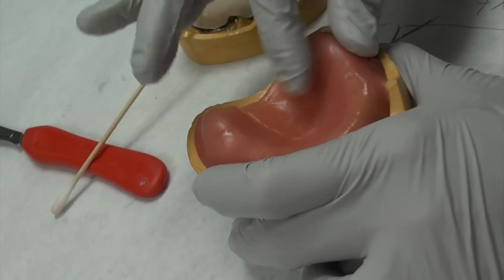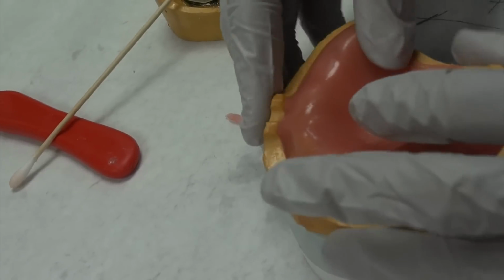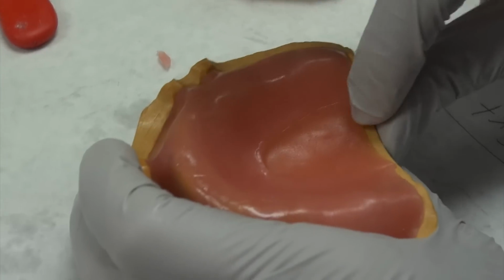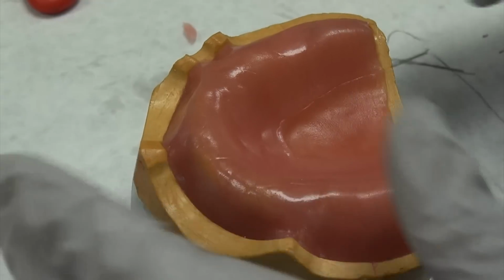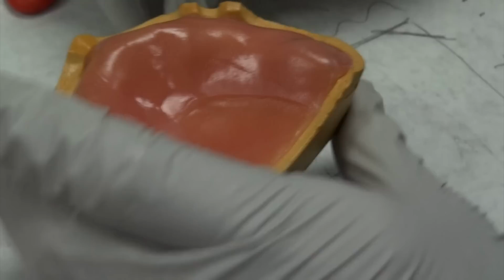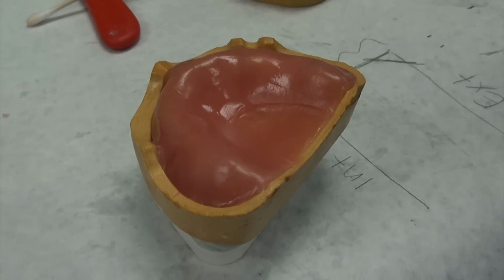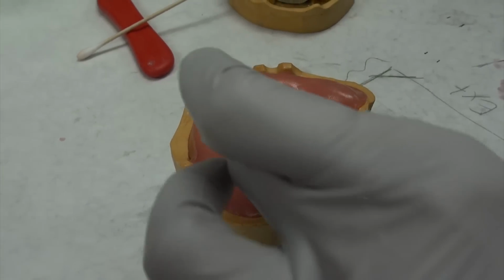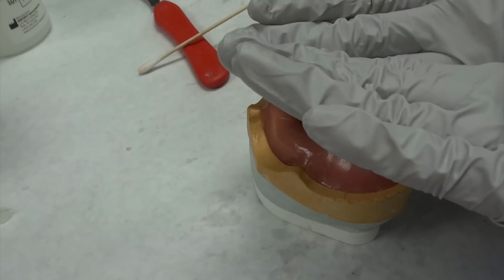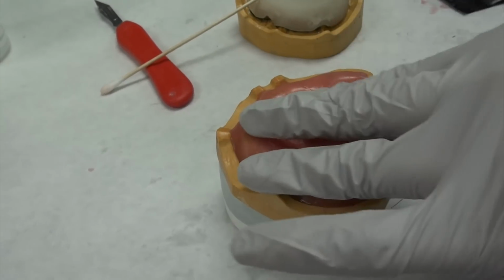So as we're putting the little piece that was missing, we're just gonna blend it back in. Okay. Now, as you notice, it's always going to seem like you don't have enough material. Now, that's going to be because of that shrinkage. So you might need to add a little bit because it's pulling away. Okay, so you're always going to need just a little bit more.